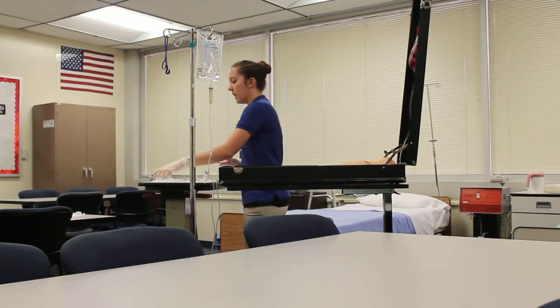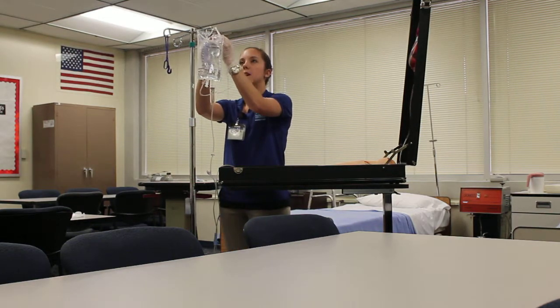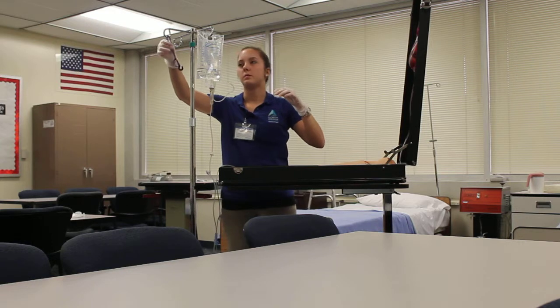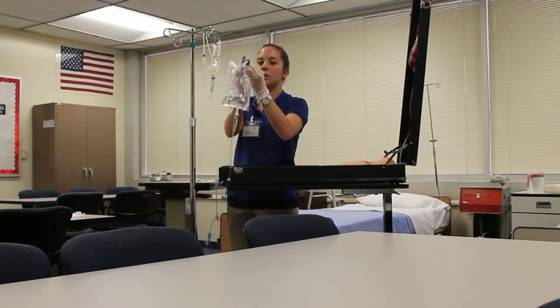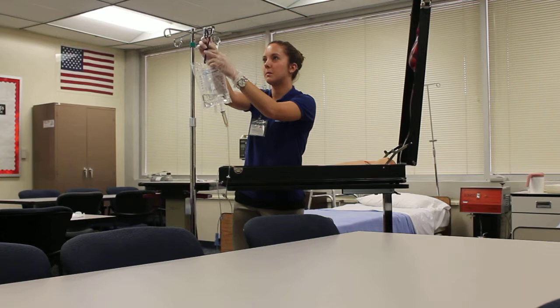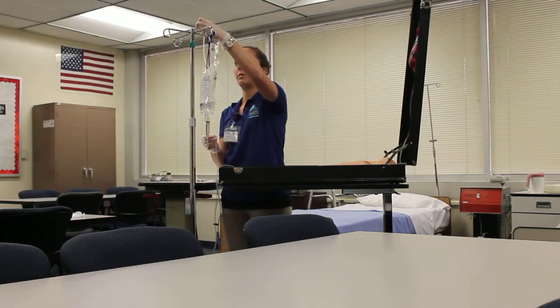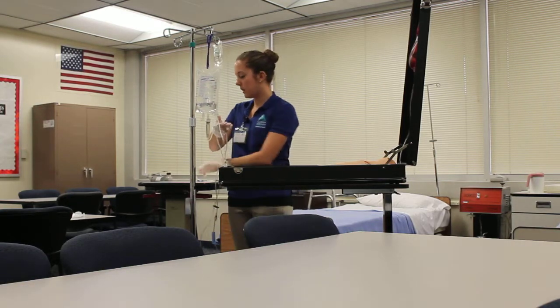At this point, I can go ahead and put my piggyback onto the IV pole. I'm going to lower my primary. I'm going to use my alcohol prep, and I'm going to clean the port of the primary as well as the port of the piggyback. And I can then connect the 2 once they're clean.